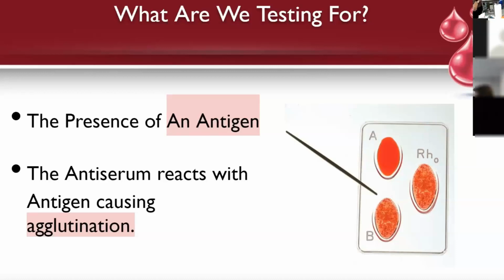But you have 4 wells. I have to give you new ones. You're going to have 4 wells. Okay? Actually, you only need 3. And we're going to do 3 blood samples. And it's best to have a white piece of paper underneath it because it's hard to see reactions on the black top. Okay? So we want to know if a certain antigen is in this blood sample.